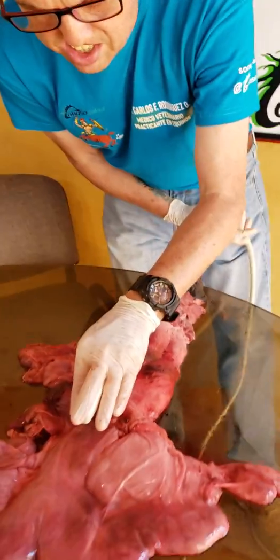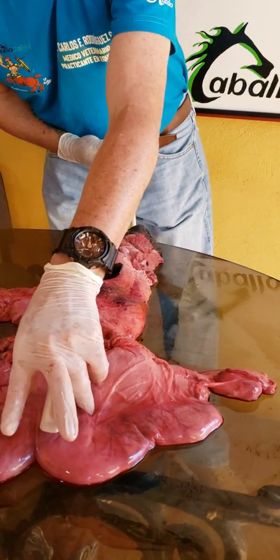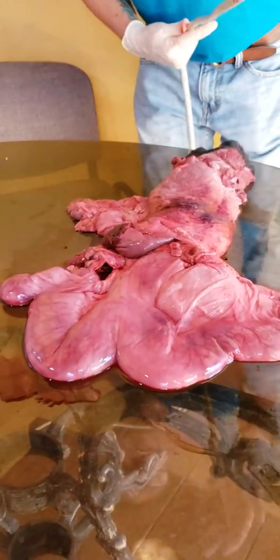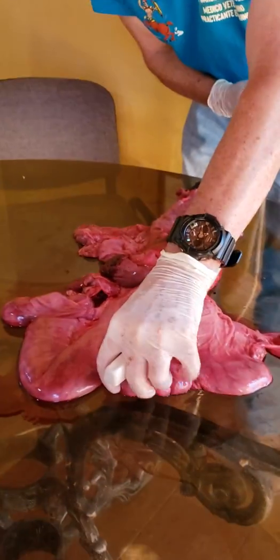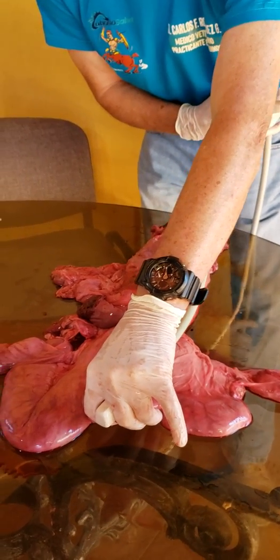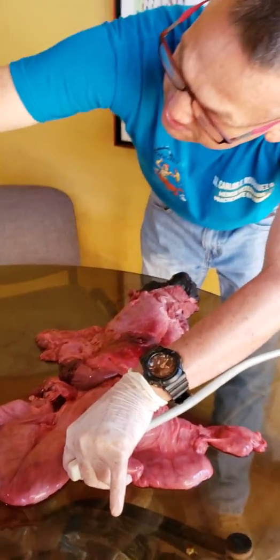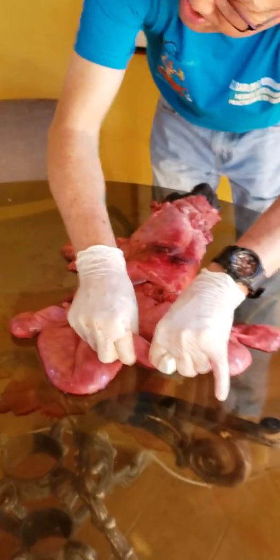You are going through the rectum and the rectal mucosa, and you are going to touch the body of the uterus. Then you are going to get the Y-shape. You can see a Y shape here — this is the left horn. I'm going to hold it like this, grabbing the uterus, touching it exactly with the ultrasound probe. You can see the uterus on the top of the machine screen.